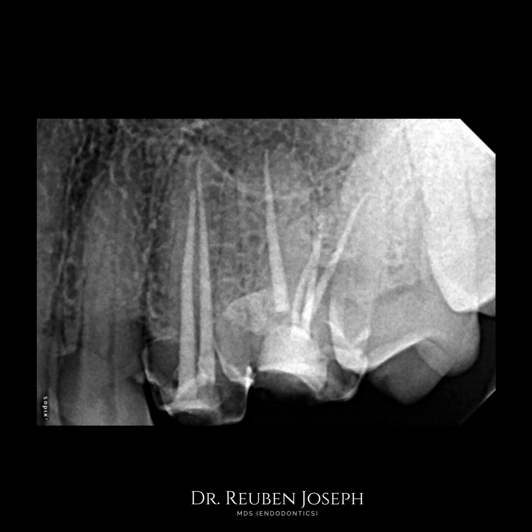A few of us might still have the doubt as to what happens if the patient develops a problem in the palatal or the distobuccal canal. The answer to this is again very simple. When you are proficient in using a microscope for your retreatment, it is very easy to go through a prosthesis and exclusively treat the problem area alone. Let me show this again with an example of another maxillary first molar which I retreated.